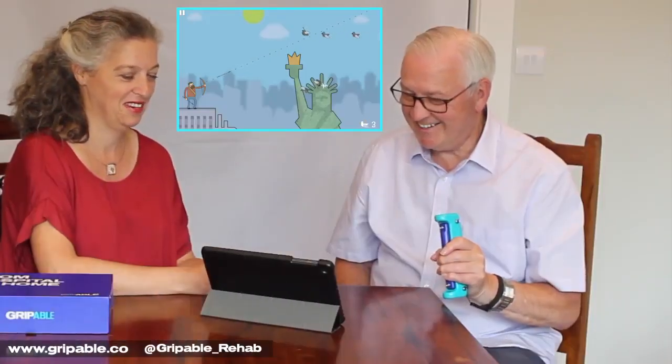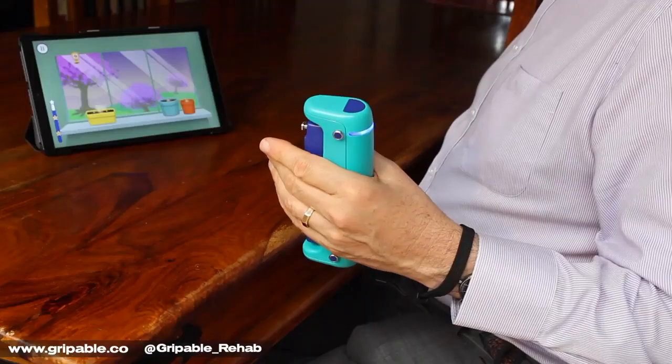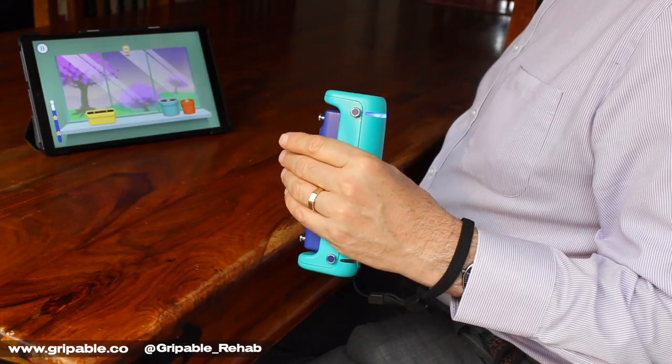Grippable is also a training device used to meet the goals of strengthening, increasing range of motion, for stability and proprioception training.